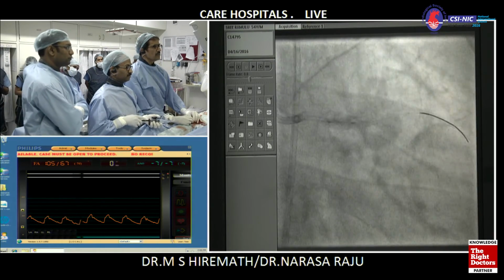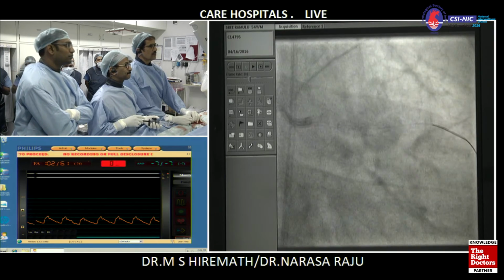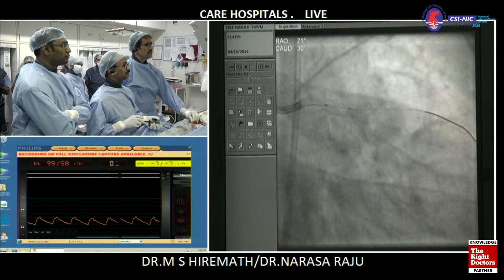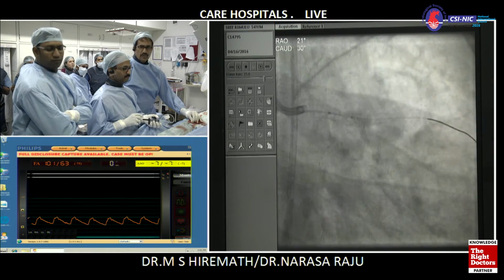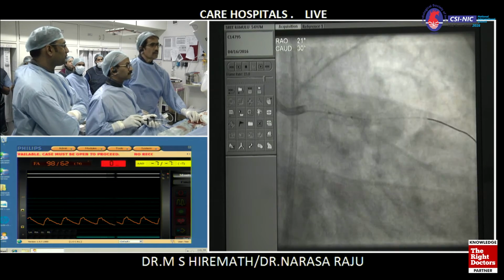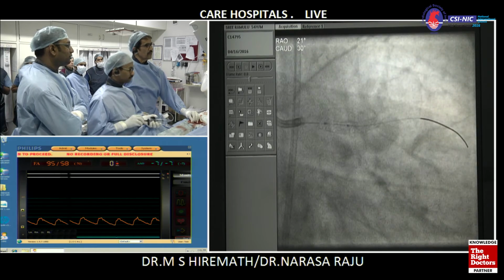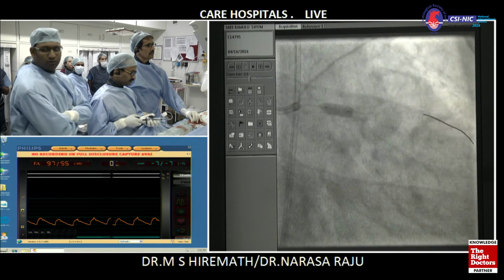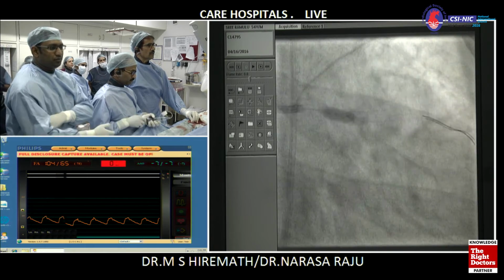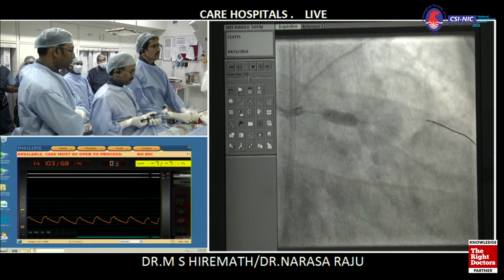Okay, get ready for stent boost. So we are using a stent boost to mark the back end. We look in good position. Shall I go ahead? Yeah, go ahead. Go ahead, dilate. 8, 10, go 12, 20, 22, 24, 26. I'm at 26. Okay.